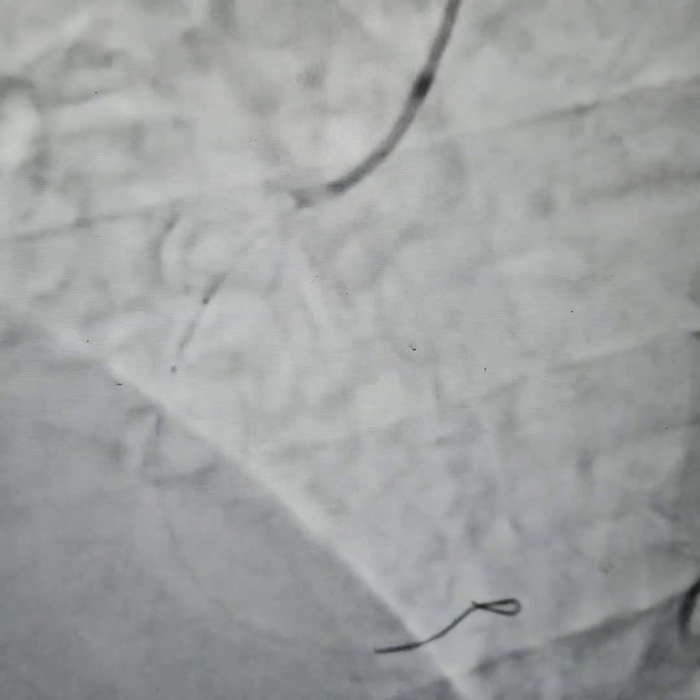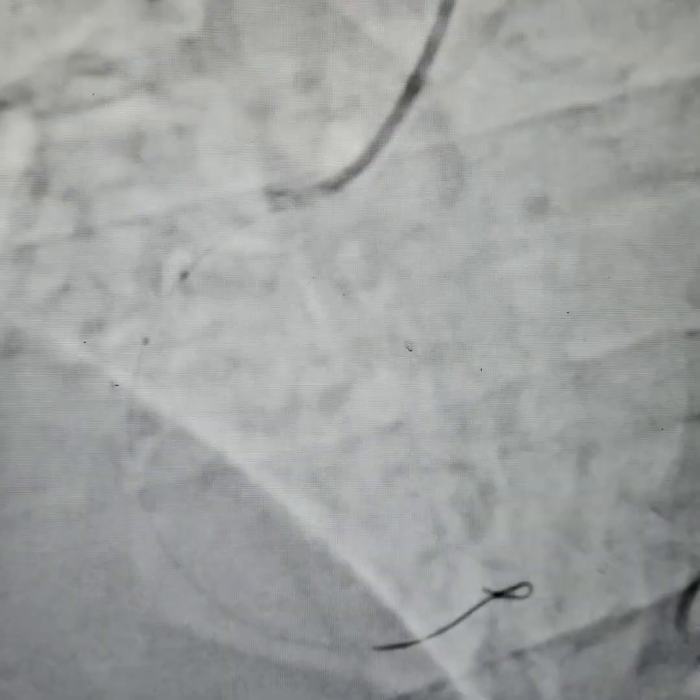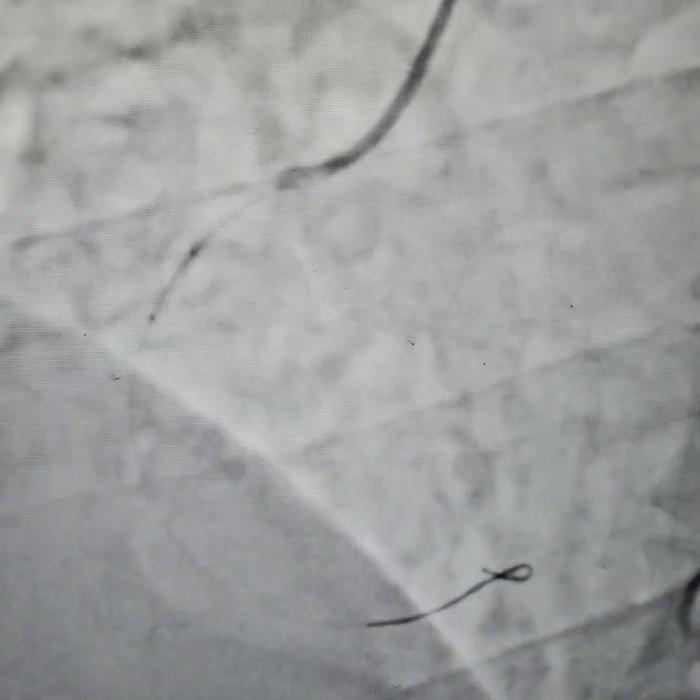This is some aggressive predilatation that we are doing with a 2.0 by 10mm balloon. We are inflating this 2.0 by 10mm balloon, and we can see that the lesion is giving way — and it's good.